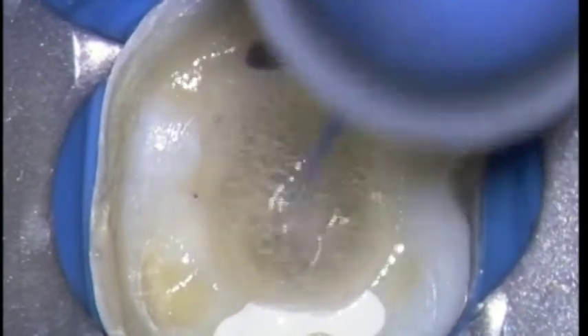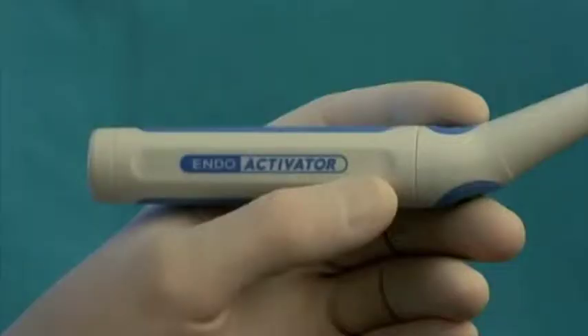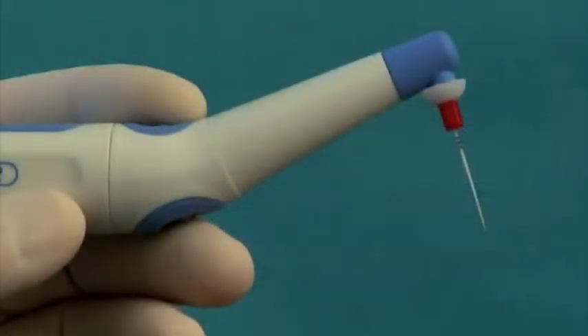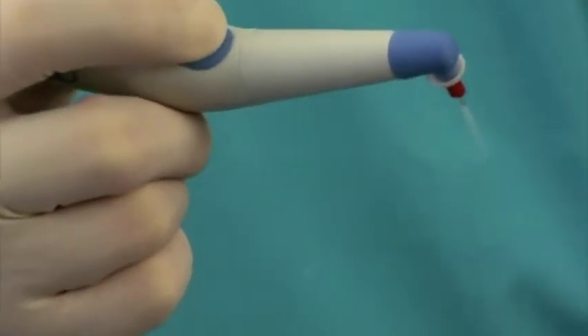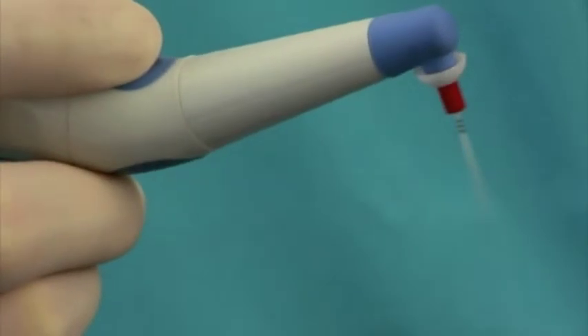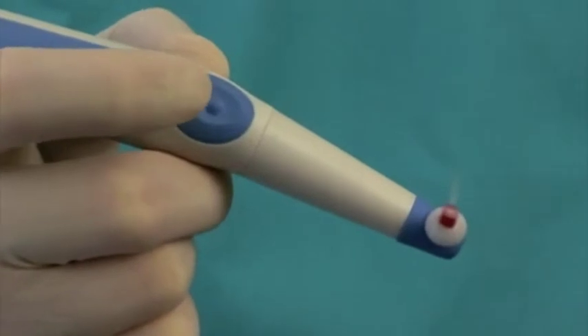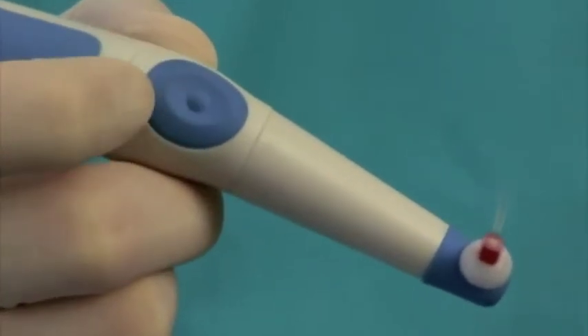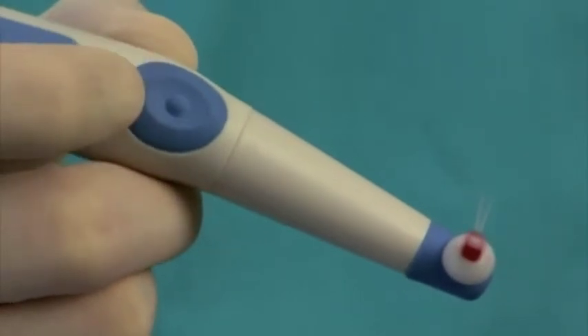Let's take a closer look at this new, innovative, and easy-to-use technology. The EndoActivator system is comprised of a cordless, contra-angled, and ergonomic handpiece that drives the EndoActivator tips. This handpiece is operated by pressing the light touch on-off switch which activates the strong and flexible polymer tips. The three-speed sonic motor switch provides options of 10,000, 6,000, and 2,000 cycles per minute.